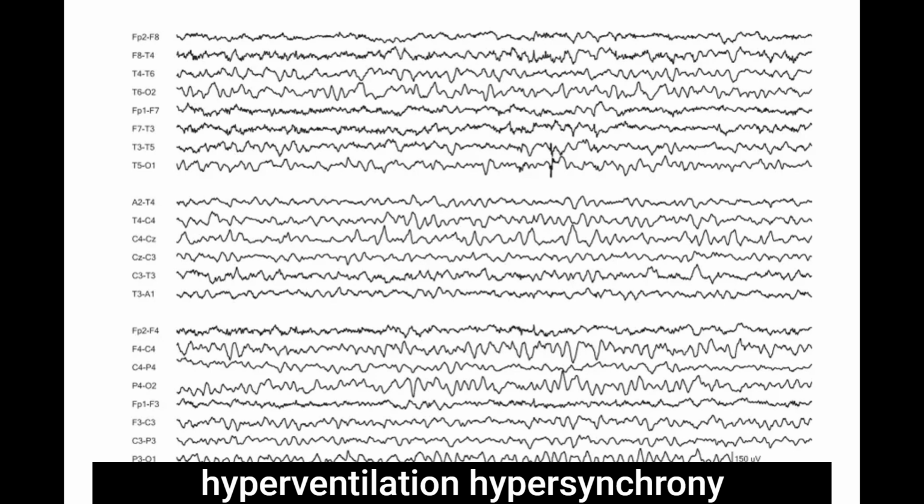And how does that affect the brainwaves? Well, it's a standard part of many EEG procedures. And for most people, this type of slowing resolves quickly after stopping hyperventilation. But if it persists, it's considered abnormal. So it's like the brain's having trouble shifting back to its normal rhythm after being thrown off by the hyperventilation. Exactly. And we call this persistent slowing the rebuild-up phenomenon. It can be a valuable clue in diagnosing certain conditions.